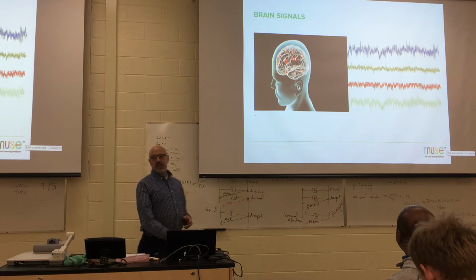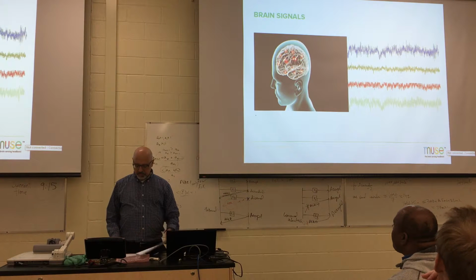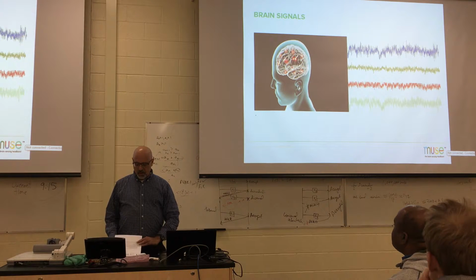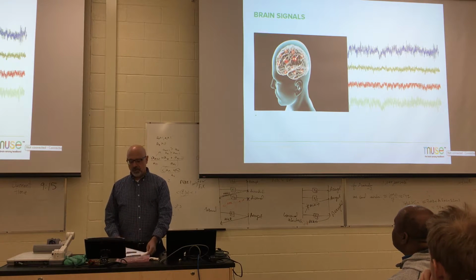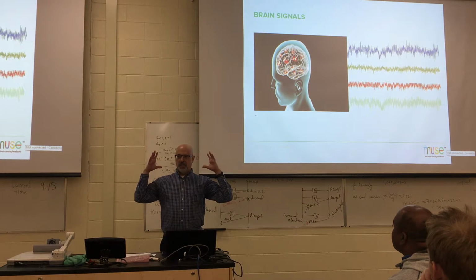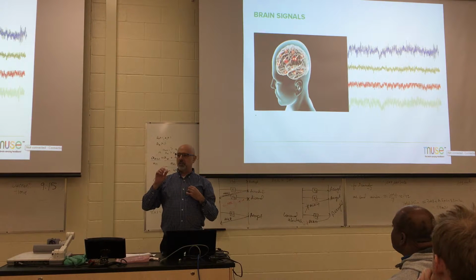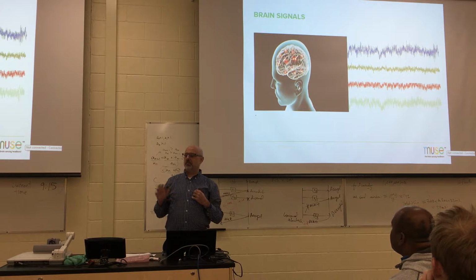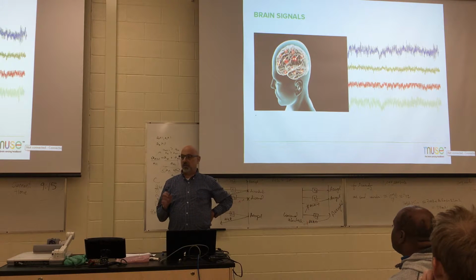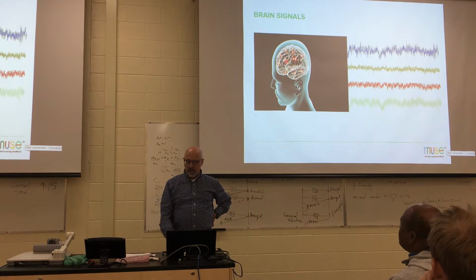So I want to move and talk about some things about physiology. We want to measure your brain signal, right? But there's all kinds of things that are going to get in the way of us getting actual brain signal, because the brain signal is like microvolts. The typical range of brain signal that we're measuring at the scalp is like plus or minus 30 microvolts. So it's very, very tiny voltages, and all kinds of things can get in the way.